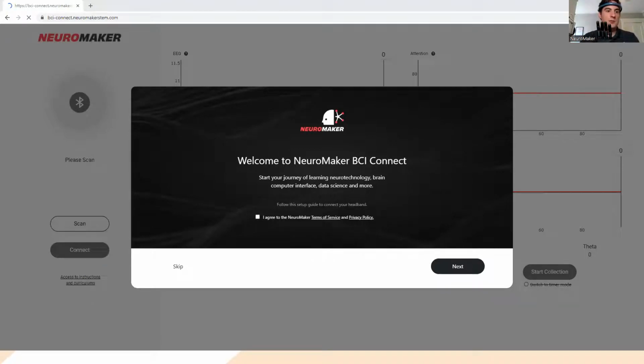And what I have this set up to do is I have 3 gestures. So there's going to be a peace sign, right, which we can call scissors if you want. We have an open palm, which we'll call paper, and we have a rock, which we'll call a fist. So when my attention score is very high, I'm going to make a rock, right, because we're really stressed, we're really focusing in on something. When we are really relaxed, I'm going to create a peace sign. And when I am in between, I'm going to create an open palm.